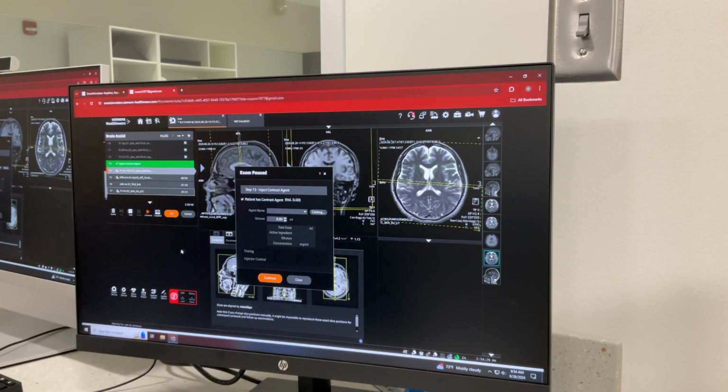You're gonna look at this top part right here, because this is the dosage administration chart for OptiMark. Different contrast agents are gonna have their own type of dosing, but this is a typical dosing. It's going by 0.1 millimoles a kilogram.